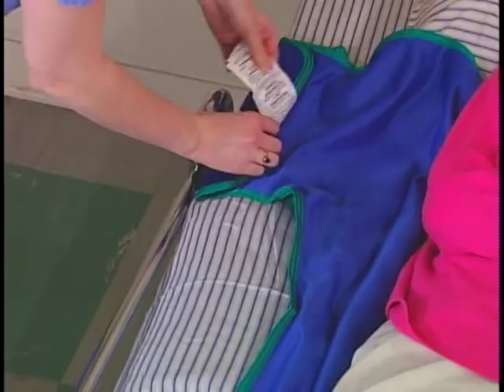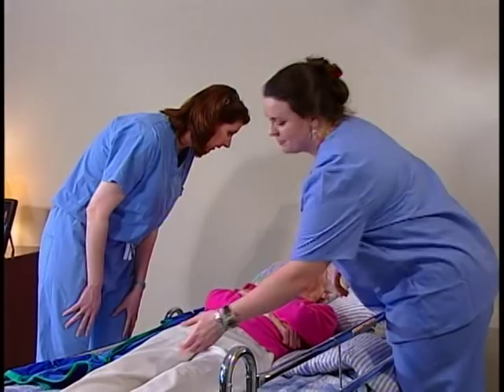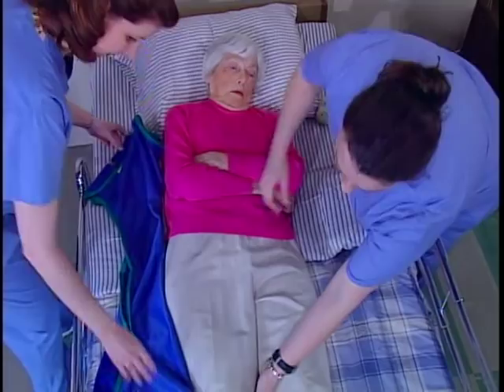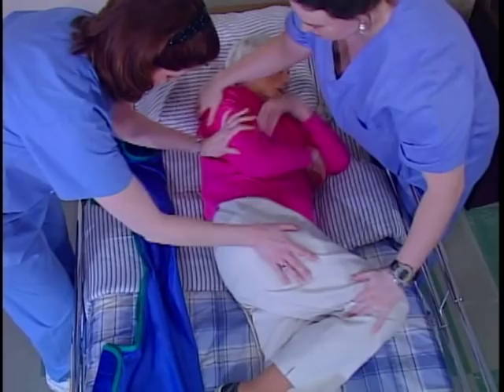Explain that you're going to roll them side to side so that you can put the sling underneath them. Have the resident lift the leg that is closest to you so that their foot is flat on the surface. Help them if they need it. Position one hand on the resident's elevated knee and the other hand under the resident's shoulder. Simultaneously push on the knee and lightly lift their shoulder. The resident will roll onto their side with relative ease.